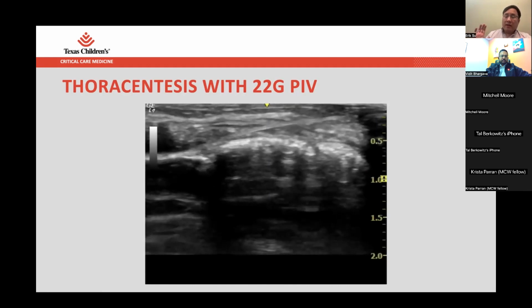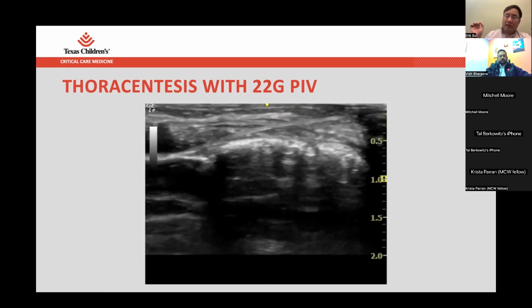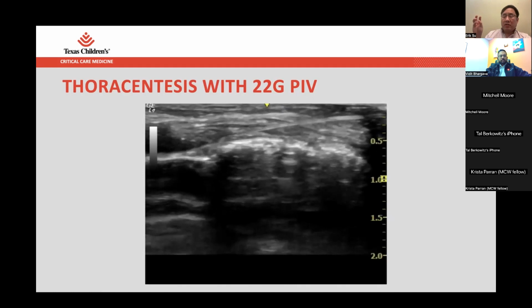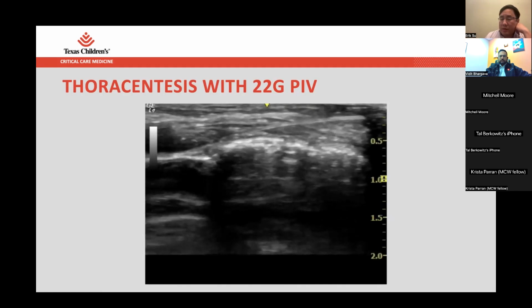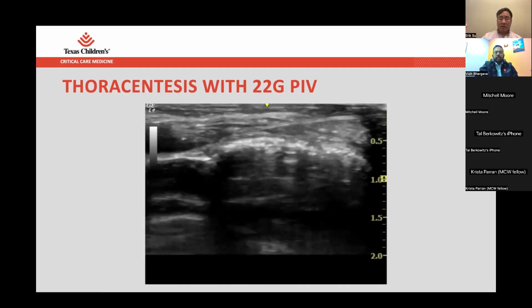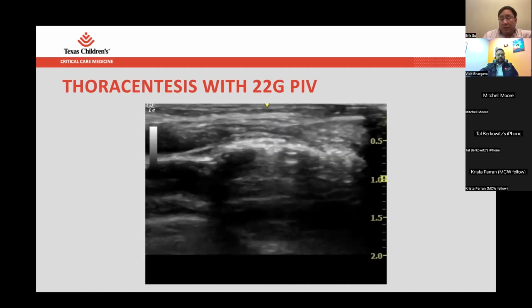Then you probably have to do a dilator switch out, where you carefully, over the 018 dilator, put the chest tube dilator, like an 035 dilator, a dilator that has an 035-inch channel on the inside, the type that goes with pericardiocentesis drains, pleural drains, and dialysis catheters. Like the micropuncture kits, where you can take out the sheath and then put in the bigger dilator. Yes, those are really nice, the dilators that have the inside dilator that comes out. Yep. That would have been even better.